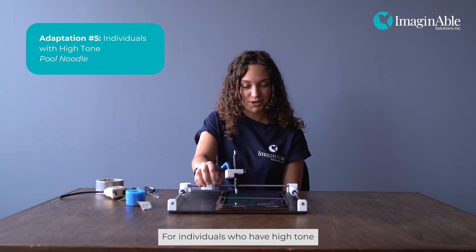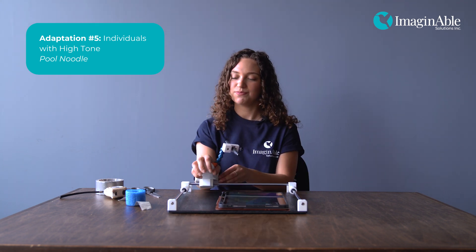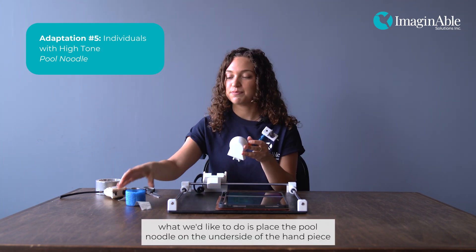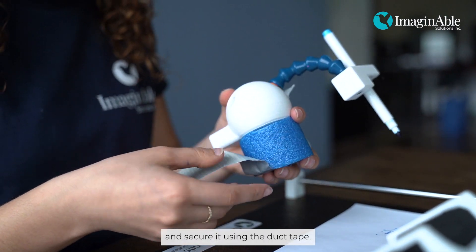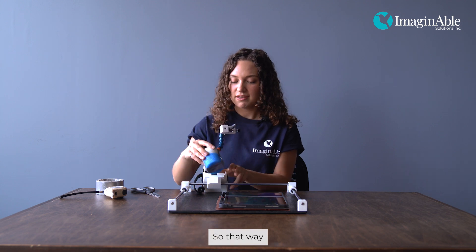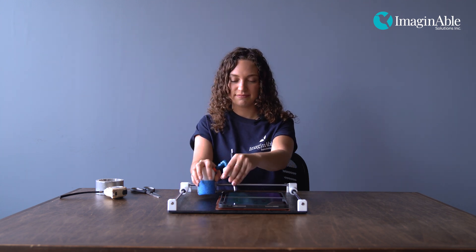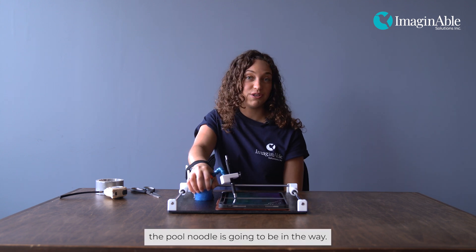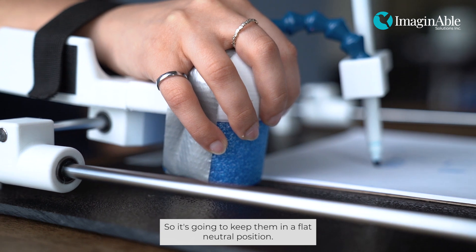For individuals who have high tone, to prevent the blue arm from moving out of the way, we place the pool noodle on the underside of the handpiece and secure it using duct tape. That way, when they try to apply pressure downwards, the pool noodle is going to be in the way, keeping them in a flat neutral position.